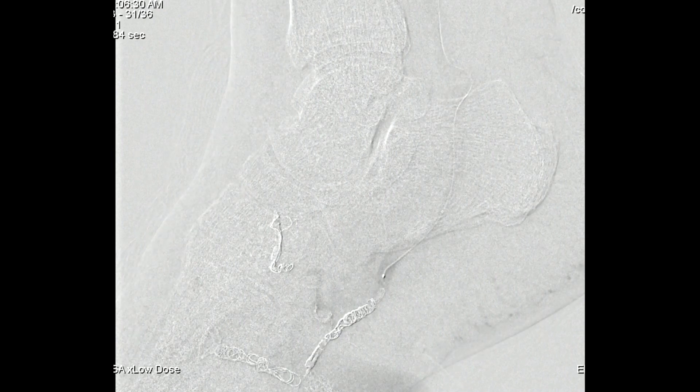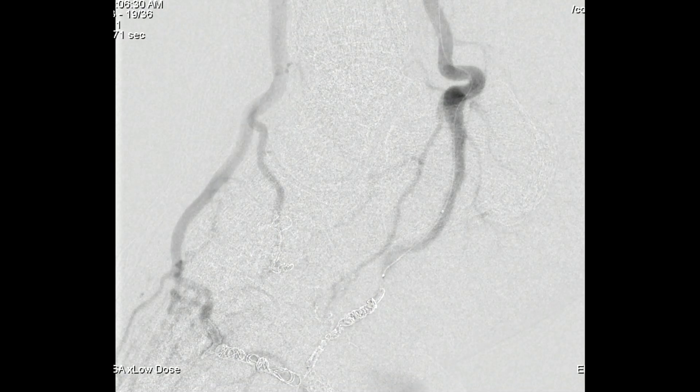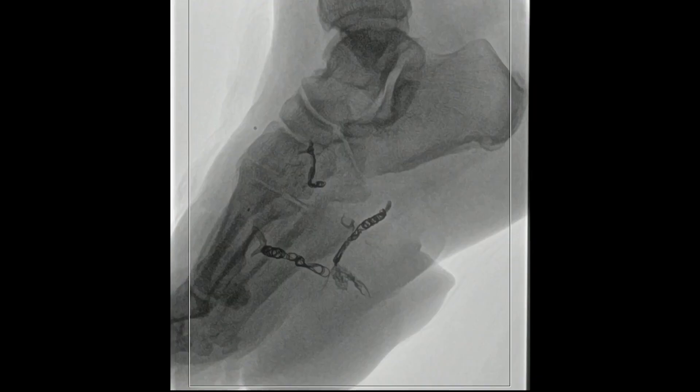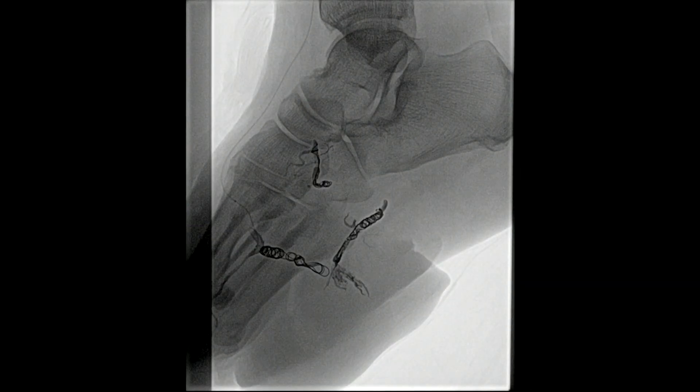We went back and re-accessed that plantar branch off the anterior tibial artery, continuing to inject onyx into it. Using road mapping you can see where the most recent onyx injection is — it's blocked off a side branch. We allowed that to harden and then pushed it into other branches and inside the coils. When you see it tracking back along a side branch, you just stop and can aspirate a little bit to prevent it from tracking too far.